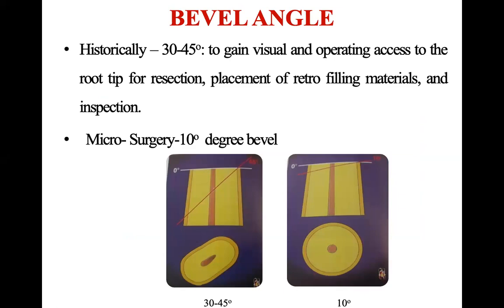Once you have cut the apex, in which direction? Do you want to make it straight or do you want to make it at an angle? See, here you see this cut is straight and you are somewhere here. Then you will not be able to see this opening.